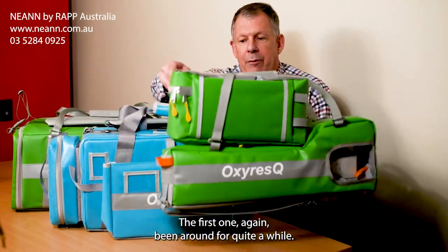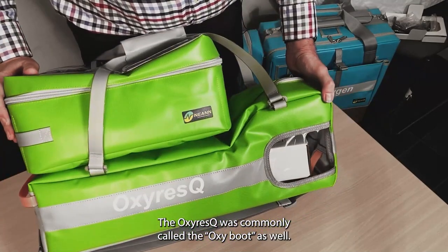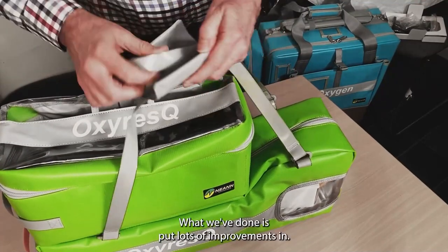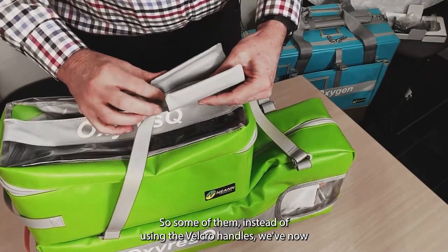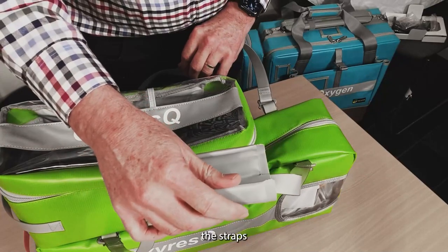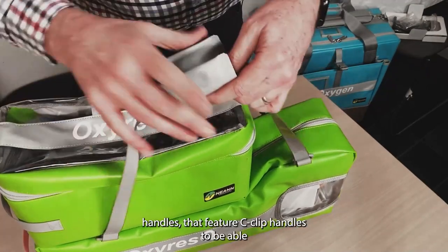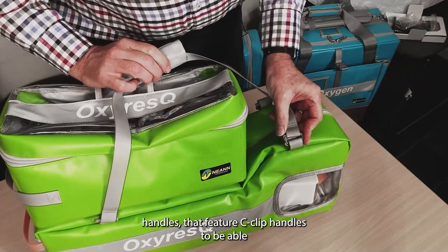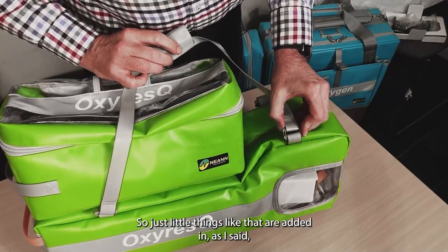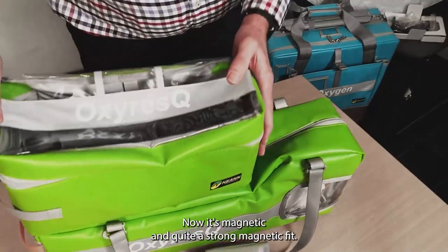The first one, which has been around for quite a while in a new and improved version, is the Oxy Rescue — commonly called the Oxy Boot, and you can see by the shape of the base kit that it is boot-shaped. We've added lots of improvements: instead of Velcro handles, we now have magnetic close handles, making it much easier to open the straps. We've also got fully coated webbing on these handles, and they feature C-clip handles so you can remove and replace them if damaged. The attachment between the two parts used to be Velcro; now it's magnetic and quite a strong fit.